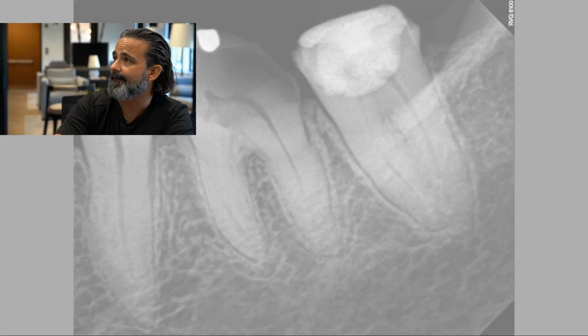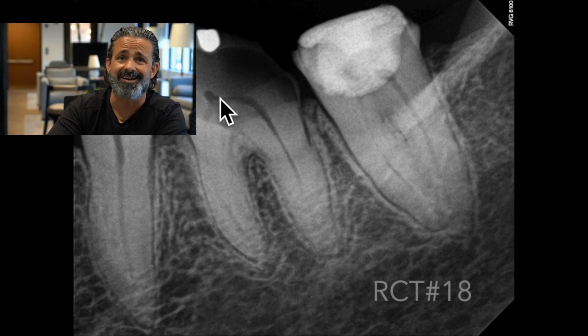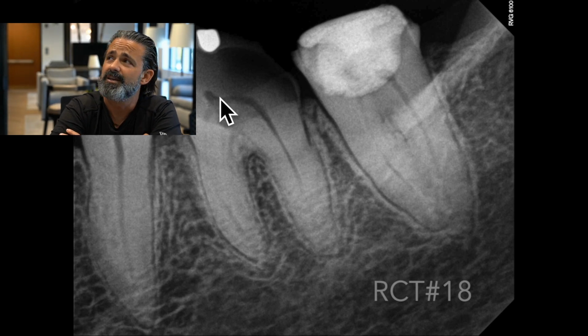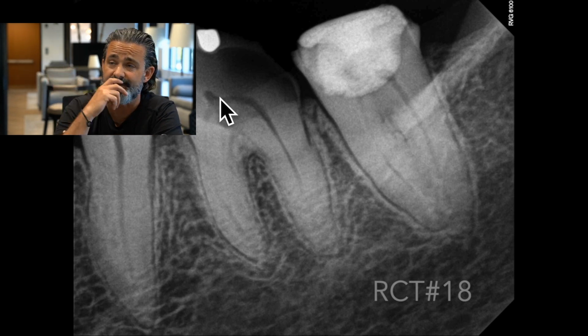Let's pull up this case. As you can see, tooth number 19 is hopeless. It's gone. It's bombed out, furcation's involved, and it's slated for extraction. We've got gingiva growing into the cavity. But 18 had been worked on, and it's very desirable in the sense that it gives the patient the restorative options the patient's looking for. It could be a bridge or an implant, preferably in 19. But regardless, 18 has some value.